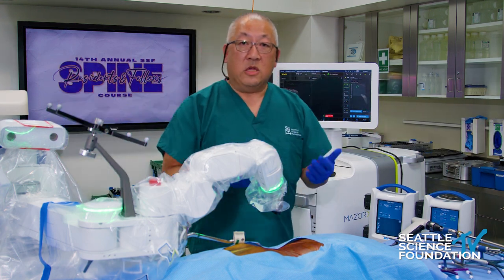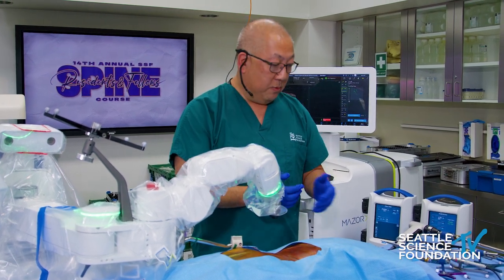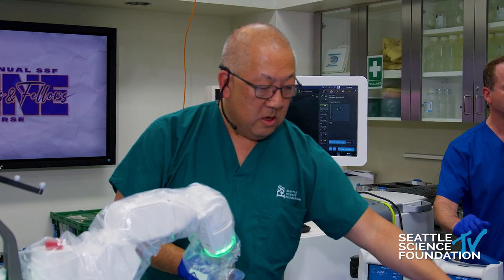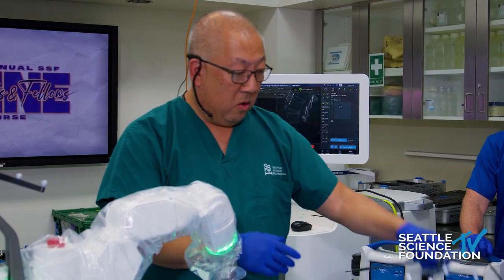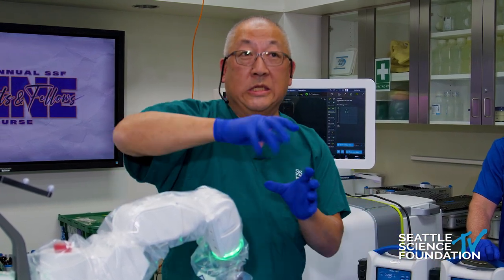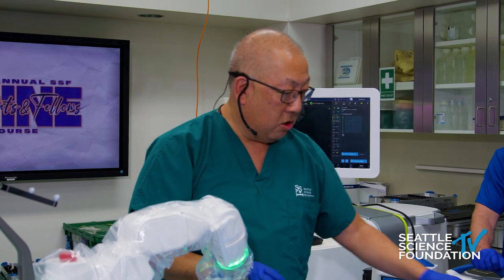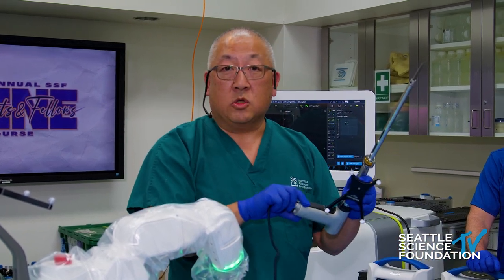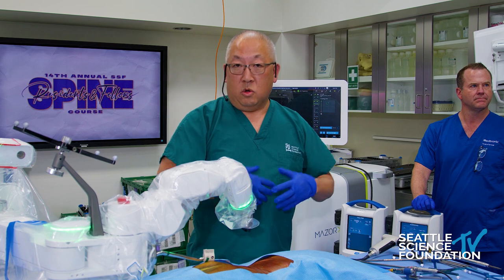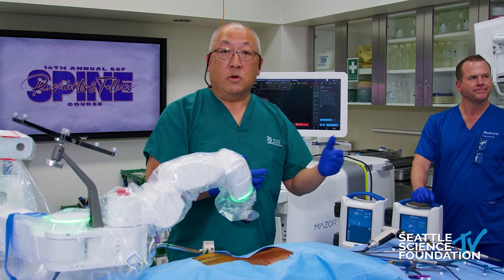We're going to show the tools — it's a very standardized setup for four steps of putting in a pedicle screw. Once we send the robot to position, it's a matter of going in with a navigated dilator and cannula, the navigated Midas for Mazor with power, navigated tap using the power drill, and a navigated powered screwdriver. For the young surgeons, save the manual tapping motion for opening beers — you can save your carpal tunnel and wrist arthritis. I was slow to adapt power for taps, drills, and screws, but as I've gotten older I've recognized the benefits of ergonomics, standardization, and reproducibility of using power.